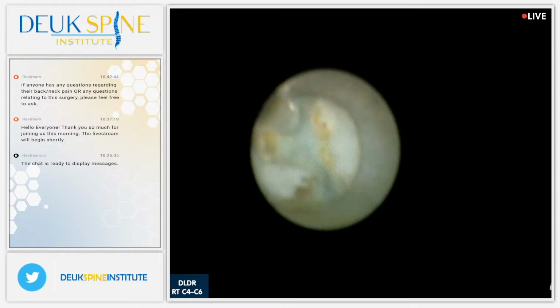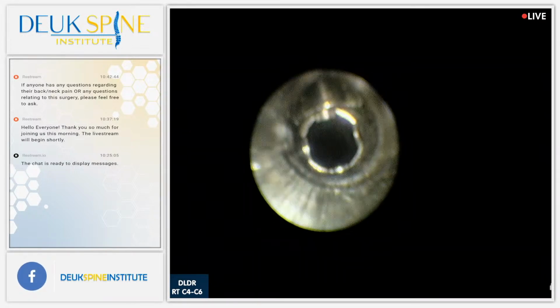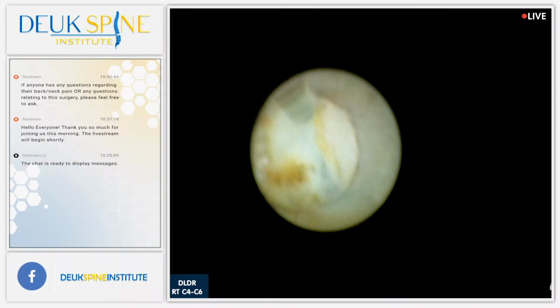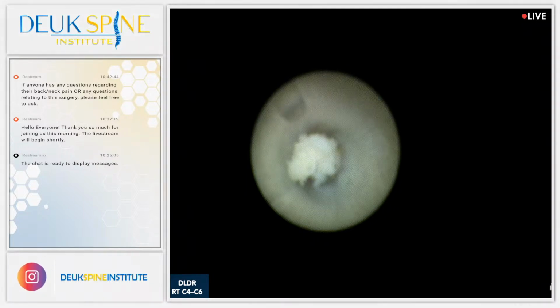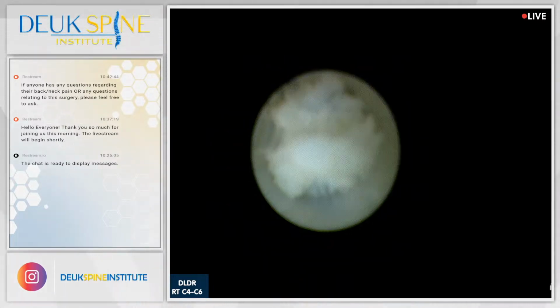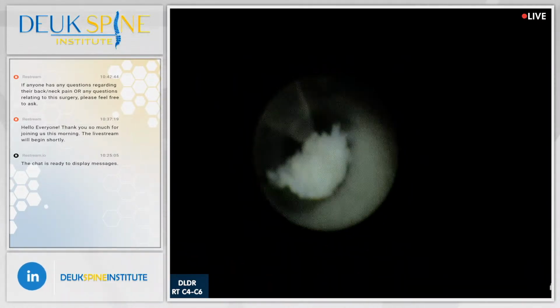So far, we just started a few minutes ago. We were already at 10. There's 11 pieces. So it's like a bag of herniations. And when it gets so big, your body is attacking it so hard, that's when all that pain and inflammation gets really bad. And that's why he's here.